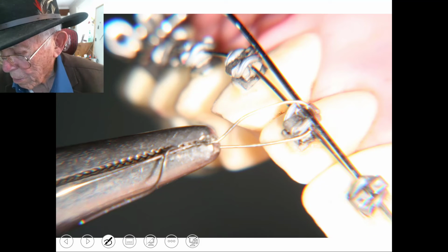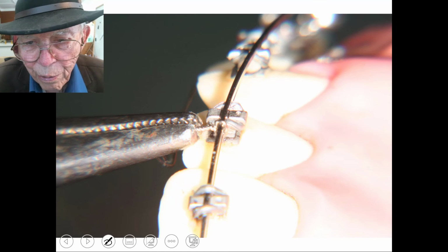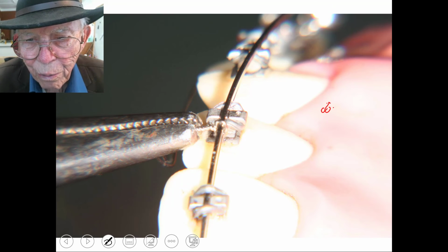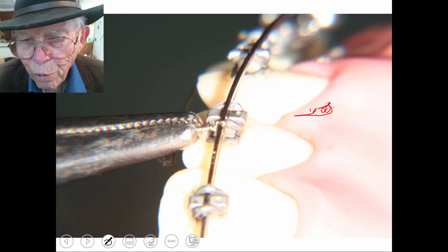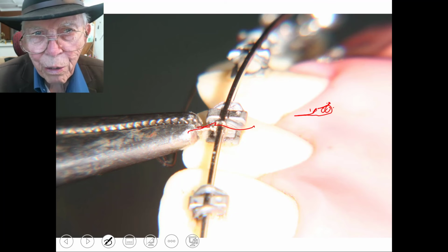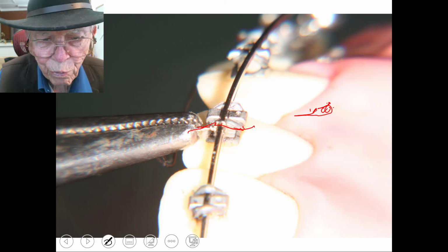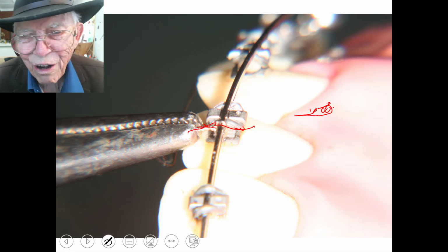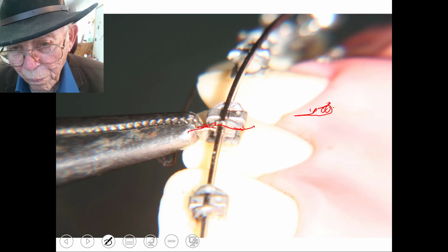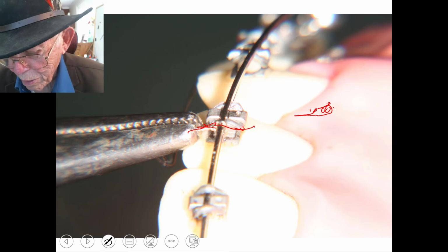Now let's see, we'll go on to tie that back, and as you tie this loop, both wires will be tied inside this thing, and it'll be kind of an oval shape. Then you twist it out here on this side, and you push it, and this twist will pop to the inside where it doesn't bother them at all. It pops back inside here, and your toothbrush and everything won't knock it out. But if it does, this thing sticks out there and really sticks you in the lip, so you want to pop it back properly, and you can't hardly get it out of that space at all.